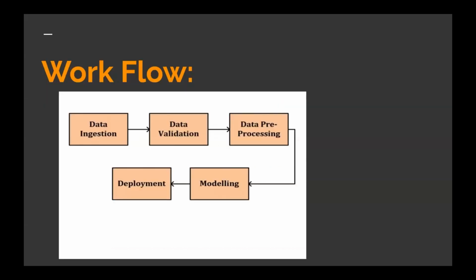This is the basic workflow of our project where we have collected the data from sources. Then we have performed various pre-processing steps on our data. Then based on that, we create a suitable model for our prediction. And lastly, after getting all the required results, we have deployed our project.